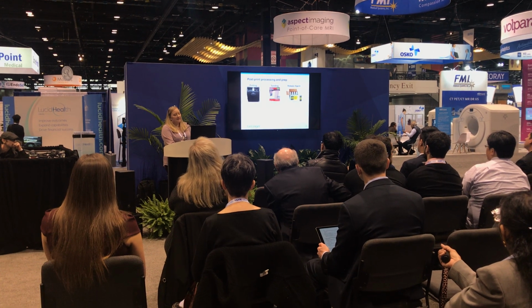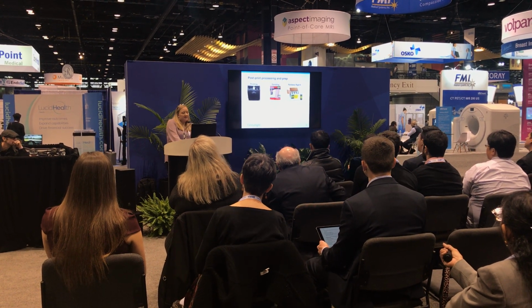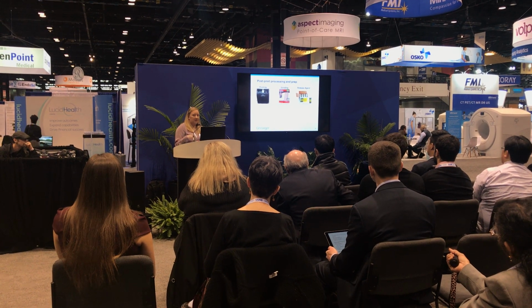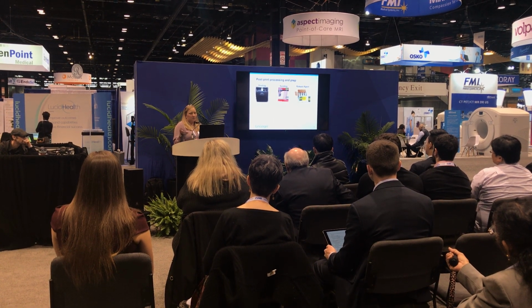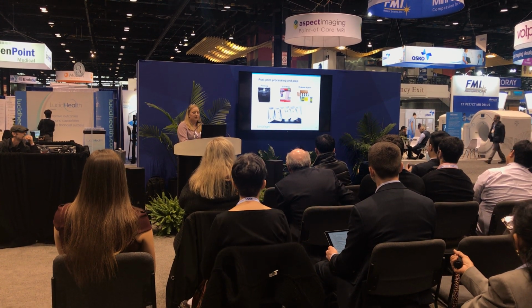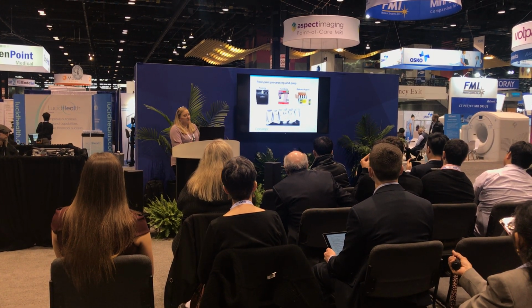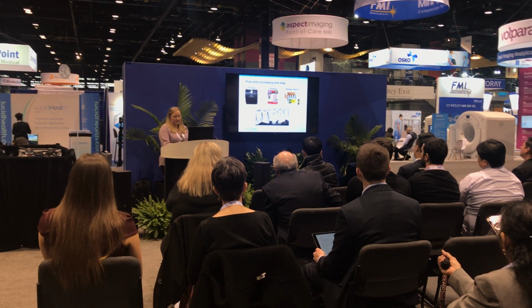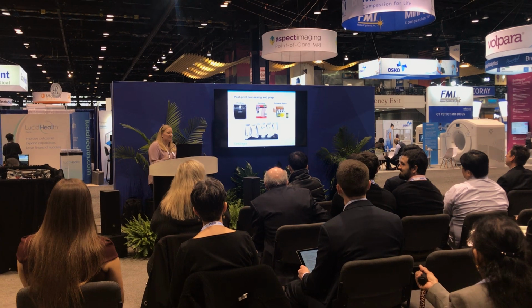And then you can use a release agent. We've noticed in the past that if you have a brand new printed mold, you're probably going to want to use it, but after one or two times pouring, you really don't need it. And these are just the molds of that lower leg. From left to right, you can see the muscle, the fat, and the skin layers, and positioning pegs to hold them all together.